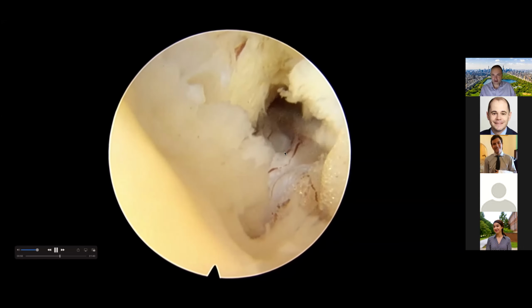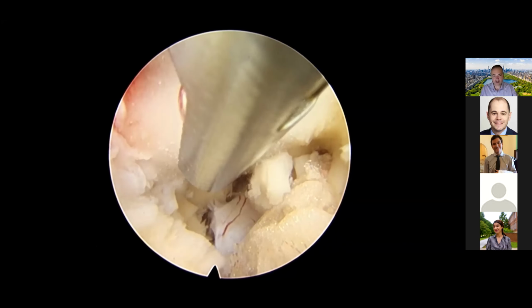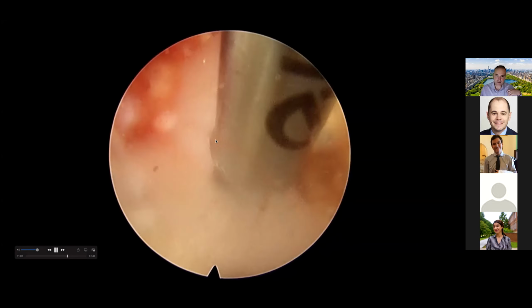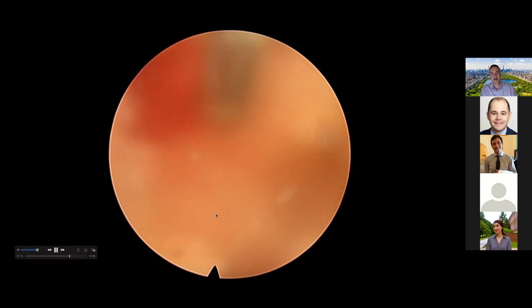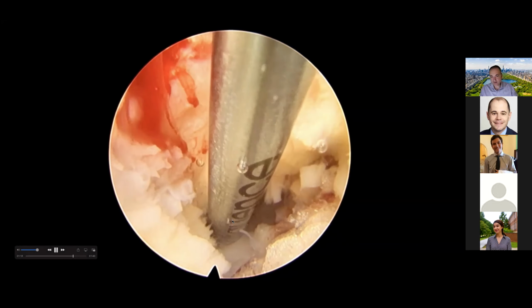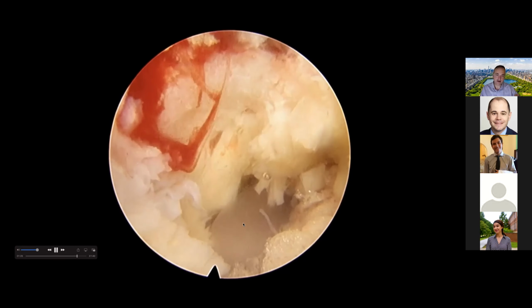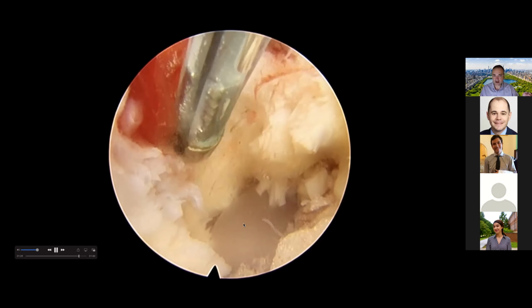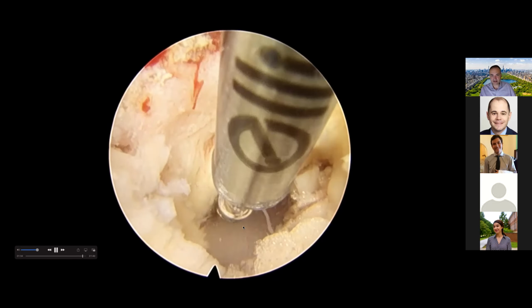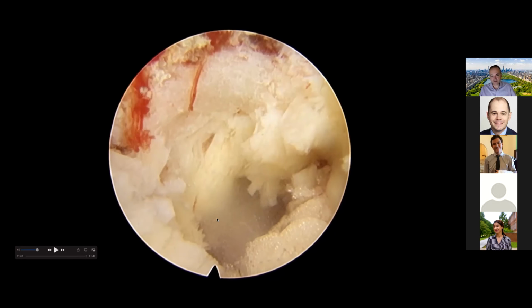It's not much bigger than the opening that happens when we're inserting a Tuohy needle for a lumbar drain. And the way we selected to repair that was basically to take a piece of Surgicel, which is this foamy material, and just plug it in. The advantage of the endoscopic technique is that because we're working through a very small incision, and a very small corridor to get down to the spine, there is very little chance of a CSF leak through the wound. So although we did not primarily repair the dura by placing a stitch, we just used that to plug it in, and the patient woke up fine without any issues.